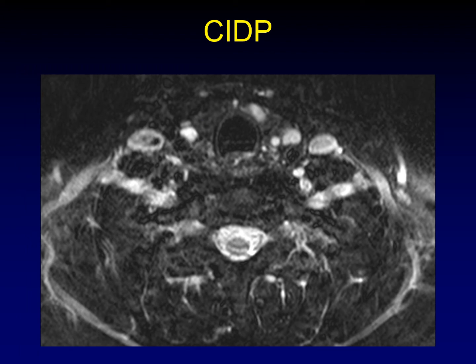Here's the same appearance in the axial plane. You can see individual nerves that are markedly enlarged. How do we know this is the brachial plexus and not lymph nodes or vessels? Here's the anterior scalene muscle, there's the middle scalene muscle — these structures are running right through the scalene triangle. What runs through the scalene triangle? The brachial plexus. So these are the three trunks of the brachial plexus on each side, markedly enlarged by the patient's inflammatory disease.